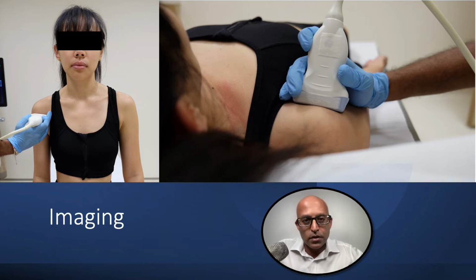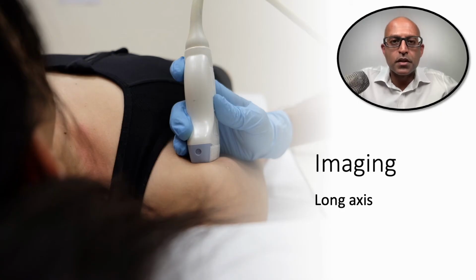There's two benefits to this. One, the subject, if they're having pain, is much more comfortable because they're not having to support the arm. And also, as the examiner, you're a little bit more stable and have a little bit more control to obtain a much clearer image. In the supine position, you can also turn the transducer into a long axis view, and it allows you to see the long head of biceps in the long axis.